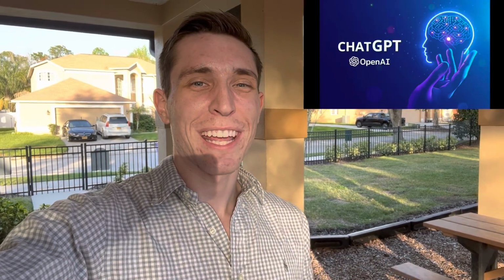Now, how was I able to use this super intelligent AI, ChatGPT, to code part of our medical device? I'm going to go into some specific examples, but first, I want to explain what ChatGPT is.